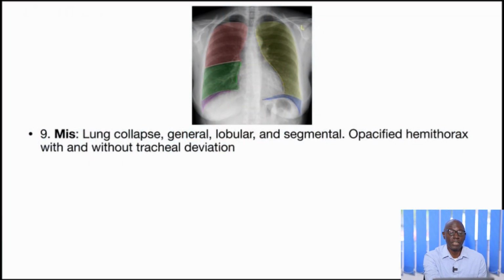The lung collapse is one other aspect which we are faced with whenever we are trying to interpret. And when the lung collapses, it may show some signs and symptoms of this. We need to recognize them and differentiate them from a consolidation. Before you do that, again, it's good to review the anatomy, and of course the upper lobe, the middle lobe, and the lower lobe, so that when they collapse, you know where they have collapsed.